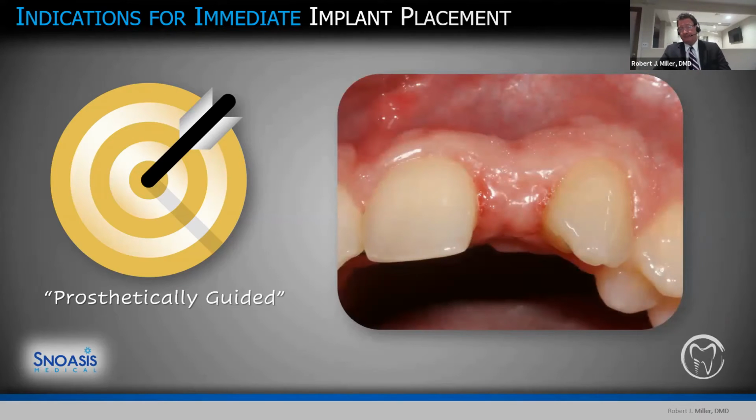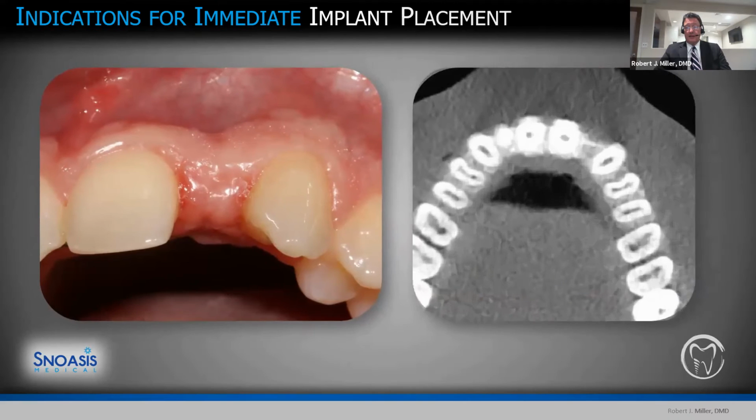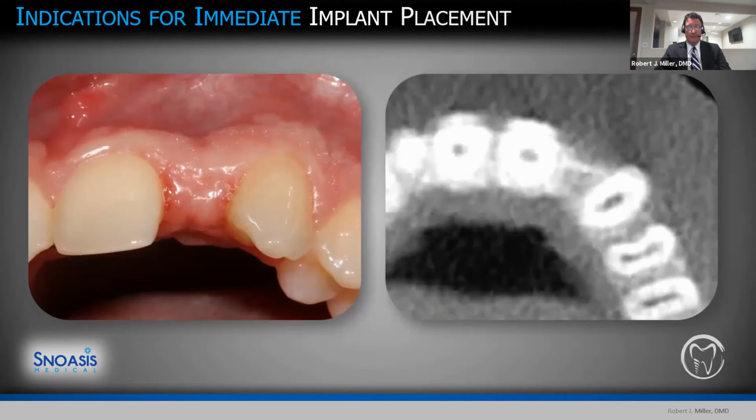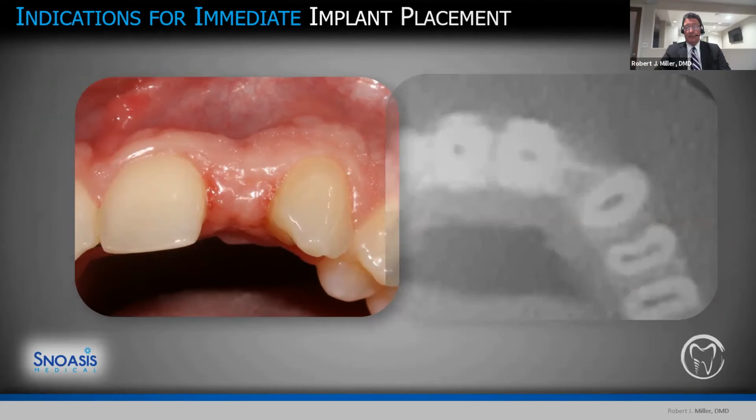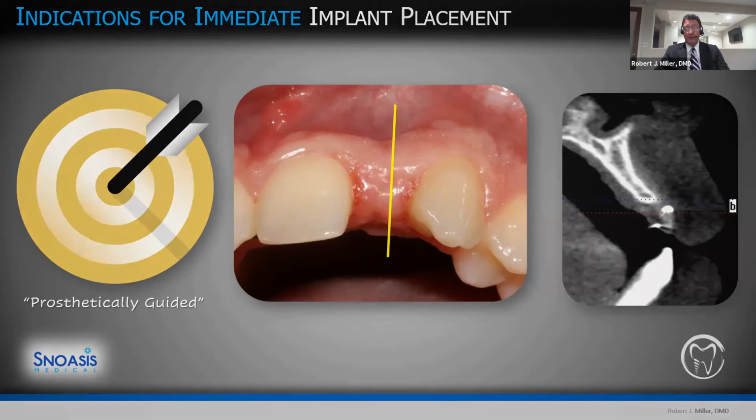Now, I'm going to show you a case here. This is a gentleman, about 26 years old. He's congenitally missing his lateral incisor and was hoping to replace this with a dental implant. You can take a look at this view. You can see we had some bone there, no question about it, but you can clearly see that there's somewhat of a concavity there. And if you take a look real closely at this particular cross-section, it is extremely, extremely thin. So we knew from reviewing our CBCT that we were going to definitely need some form of regeneration to make this, number one, a more predictable site for implant placement and also hopefully improve the aesthetics.